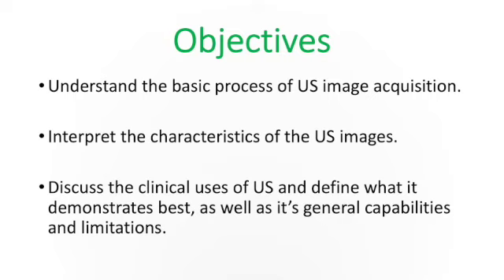So just understand and realize that ultrasound has a lot of benefits, but at the same time, you really need to know your anatomy intently and then need to be able to transpose your knowledge of anatomy to what is actually happening on the ultrasound screen, because there's a little bit of a spatial difference, if you will.